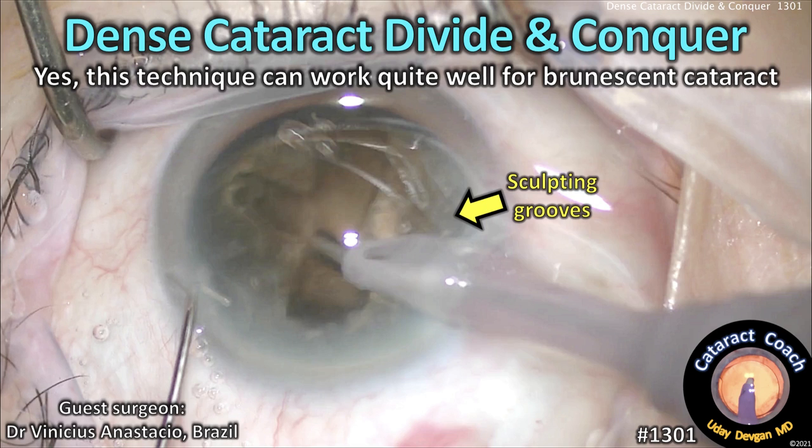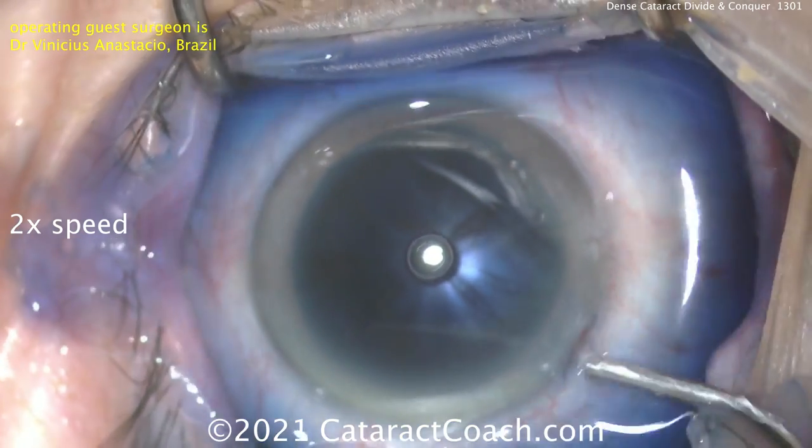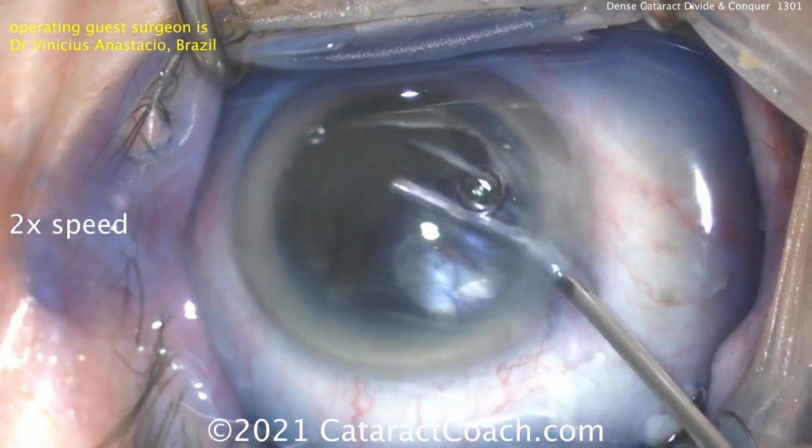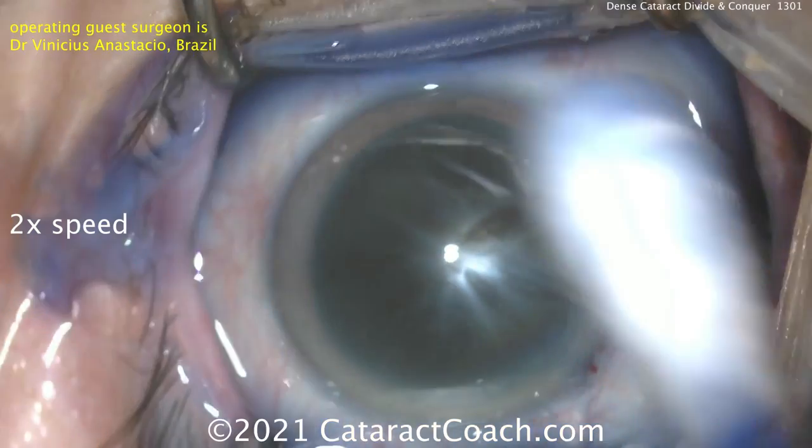This technique can work quite well for a brunescent cataract. Our guest surgeon here is Dr. Vinicius Anastasio from Brazil. We're going to show you the video at two times normal speed. You can see this is a very dense, brunescent cataract.